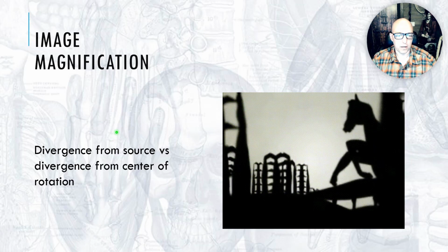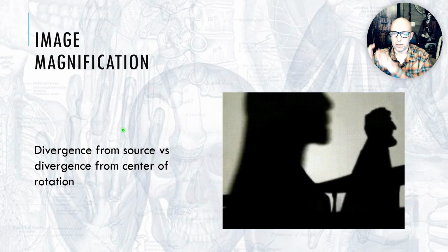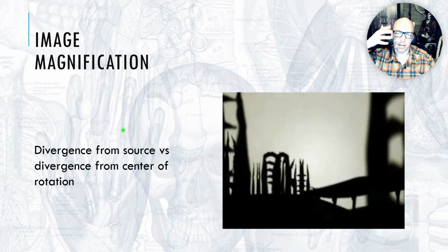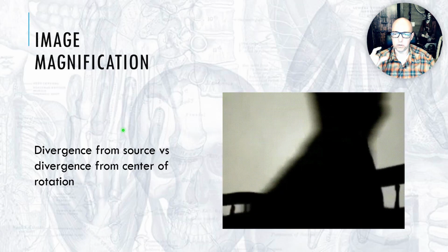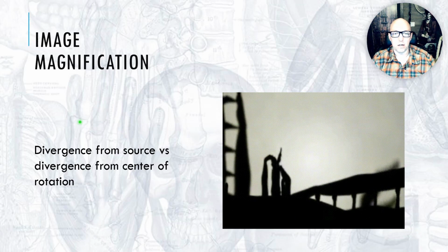But panoramic radiography is a little bit different because, yes, the X-rays are coming from a point source, but it's collimated vertically. So you have this vertically collimated beam, and as I said, it's coming from behind the patient and projects up like this. In the vertical dimension, the magnification is based on the source point and the distance from the source point. Think of a pano, where the source is way back here as it goes behind the patient. And how is it different for the horizontal?